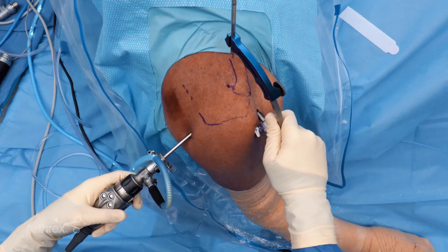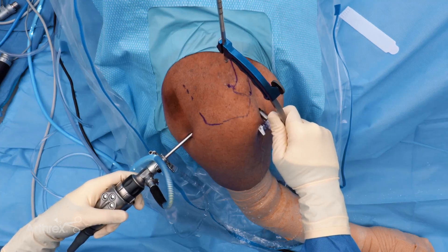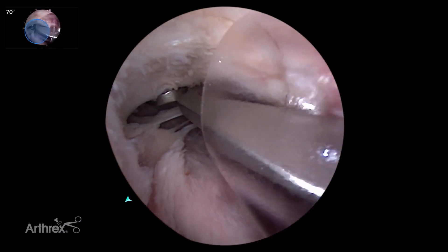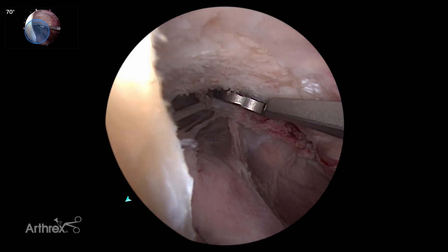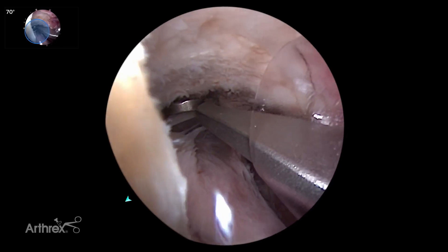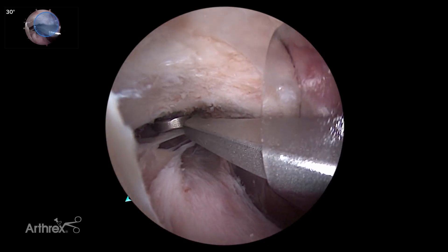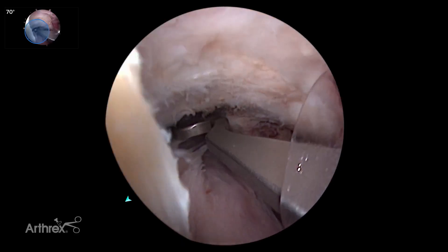We've established our subcoracoid vault, which is where we want to visualize the pin coming through. I've got my guide through the anterolateral portal. I'm in 70-degree mode and I can follow the superior edge of the subscap to get a sense of where I am medial to lateral. You want to avoid coming out too anterior where you risk fracturing the coracoid, and make sure you're at the base of the coracoid. I can scroll through with the Panascope — 30-degree, Panascope view, and 70-degree — to get comfortable and place my drill hole exactly where I want it anatomically.